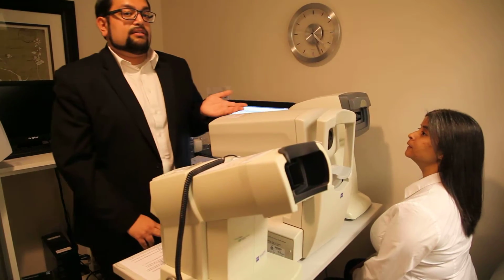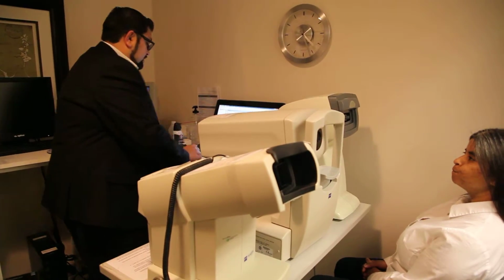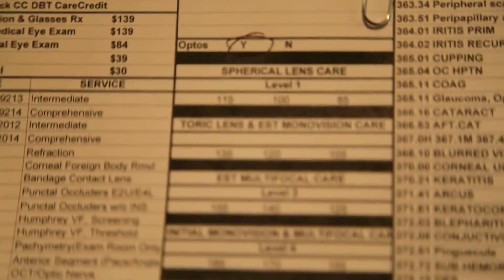Once you've explained that to them, they will let you know whether or not they'd like to do it, at which point you will indicate on their chart, on their fee sheet, under Optos, whether or not they'd like to do it or not. This patient has indicated that they would like to do it, so you would indicate yes.